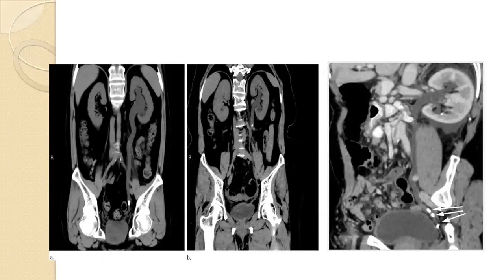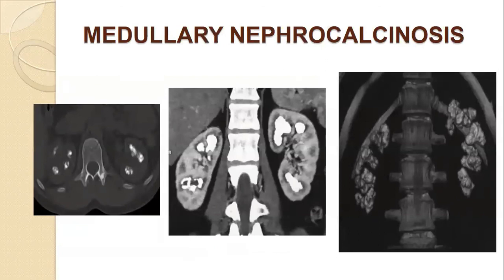Okay? Good. There are distal ureteric stones with proximal ureteric dilatation or hydroureter. You see that? Again, a proximal ureteric stone and distal multiple ureteric stones. What is the definition of this? After that. Okay? So these are pictures of medullary nephrocalcinosis, CT pictures of medullary nephrocalcinosis.